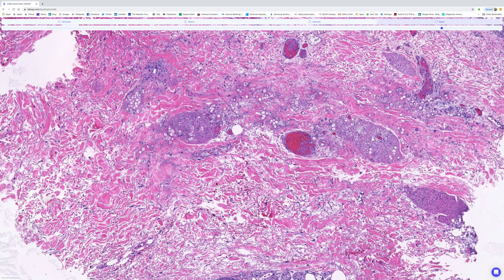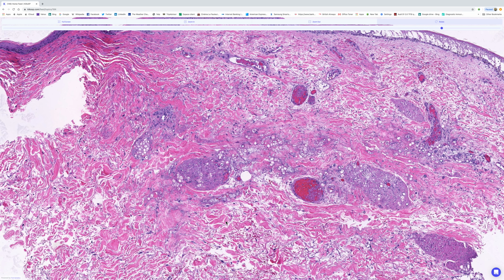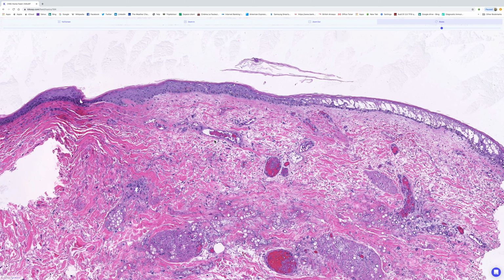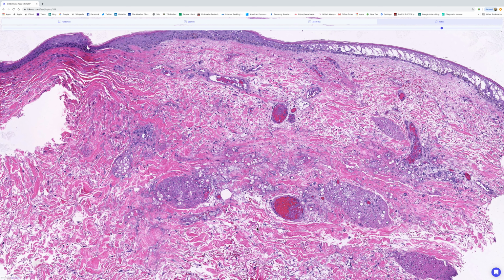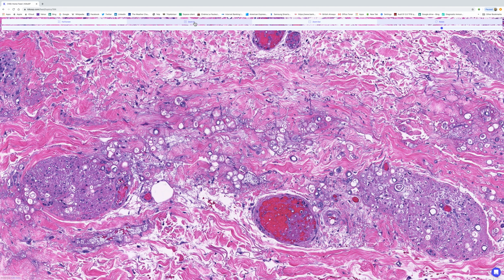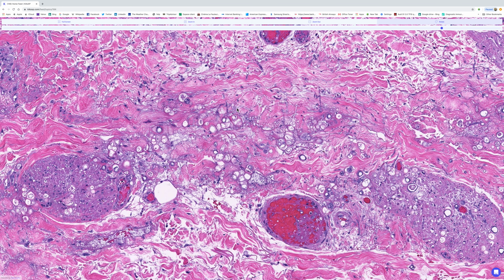I mean, isn't that just such an amazing histological field? It's just mind-blowing. There are thrombosed vessels, intensely congested vessels. The dermis is stuffed full of conidia, and even at this magnification, you can see scattered hyphae. I'll zoom in a bit. Let's see, we'll get our maximum zoom there, and you can see, isn't that just beautiful?